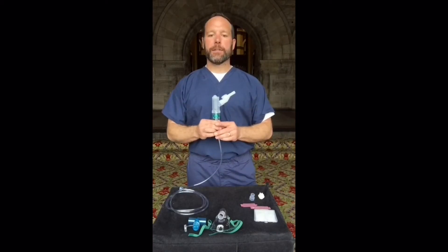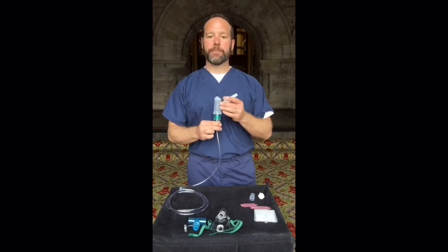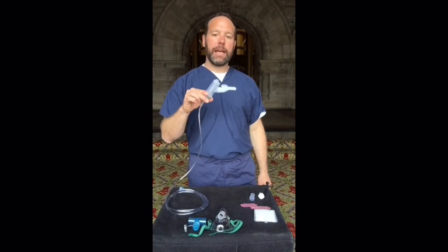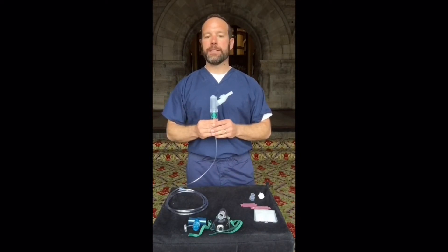Turn the Nebutek on. Most patients will take a mouthpiece treatment. The Nebutek is good at angles up to about 40 degrees in any direction. Do be careful that if a patient is reclined far and the Nebutek goes beyond parallel to the ground, the medication can come out the mouthpiece directly into the patient's mouth. This is typically uncomfortable for the patient and should be avoided if possible.